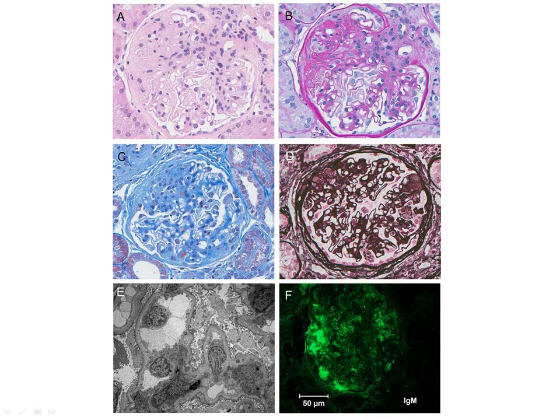And this is the important thing. When you're talking about EM, you want to talk about electron-dense deposits. You don't want to flat out call them immune complexes, because we can't tell that they're immune complexes. We can say electron-dense deposits. In parentheses, you could say suggestive of immune complexes, but right when you're looking at EM, it's electron-dense versus electron-lucent. Remember that.